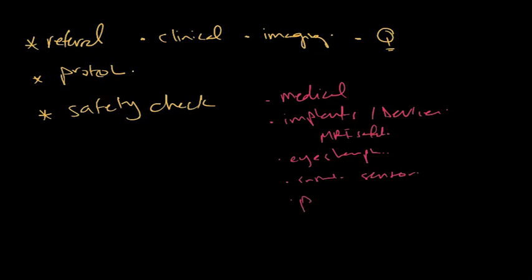You need to know if your patient is pregnant or breastfeeding. Usually we don't do scans in the very early pregnancy. We don't give gadolinium contrast during pregnancy. Breastfeeding, we can give gadolinium contrast, but usually we discuss with the mother and see if she wants to stop breastfeeding, like for a day or two, or maybe she decides not to have gadolinium altogether.